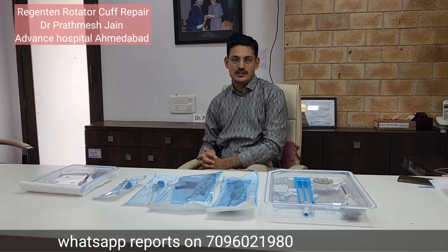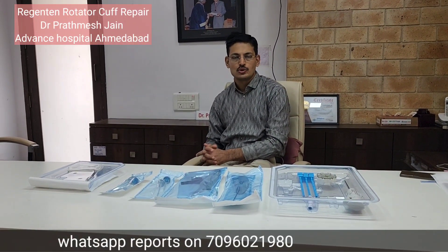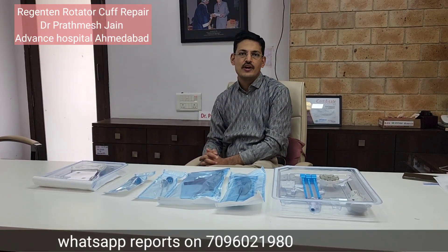Regenten technology is the world's most advanced technology to repair rotator cuff tears. Regenten is basically a patch which is bio-inductive and helps in the ingrowth of tissue. It is very helpful in two main scenarios.